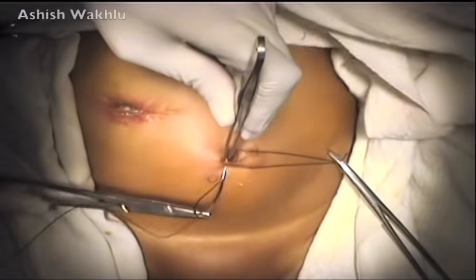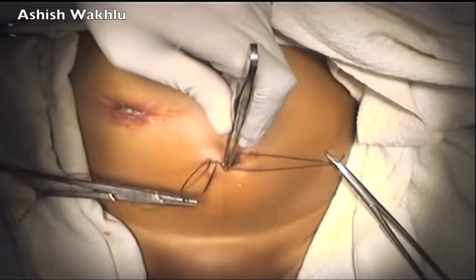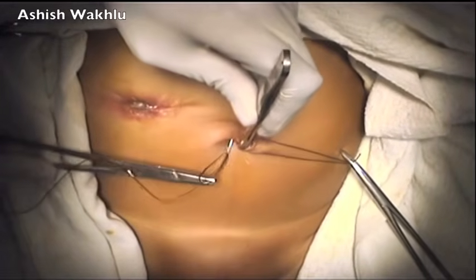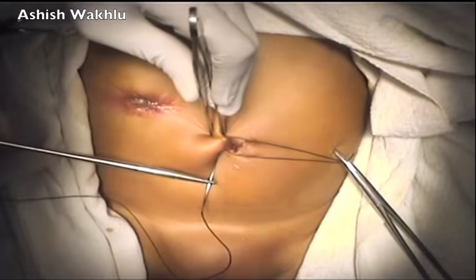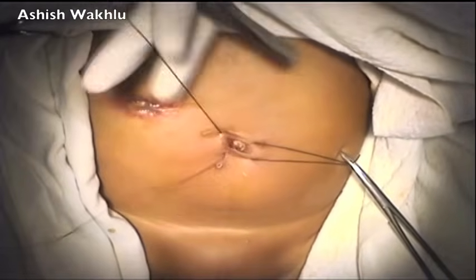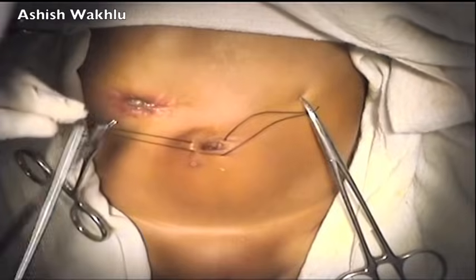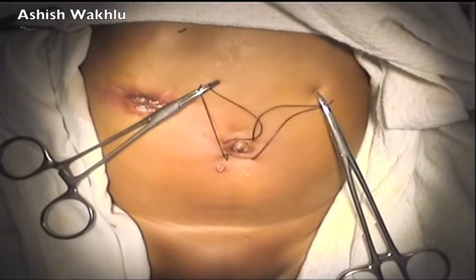Three ports were inserted for the procedure: an umbilical port for the telescope, a left upper abdominal port, and a right abdominal port inferolateral to the colostomy position for the hand instruments.